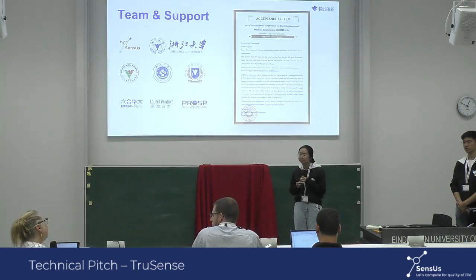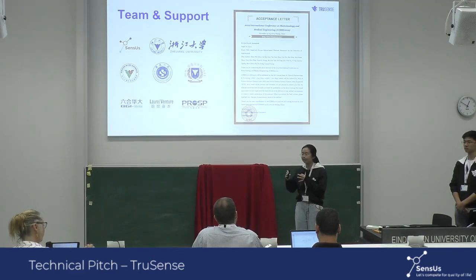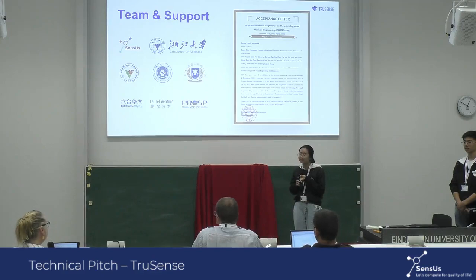And the time of your measurements, can you do it in the 5 minutes span? Yes, because we have already tested the baseline of the chips and chemical modification. So when testing, the actual step we are going to do is washing the chips. Right. So 5 minutes is good for our results. Okay, I just wanted to be clear.